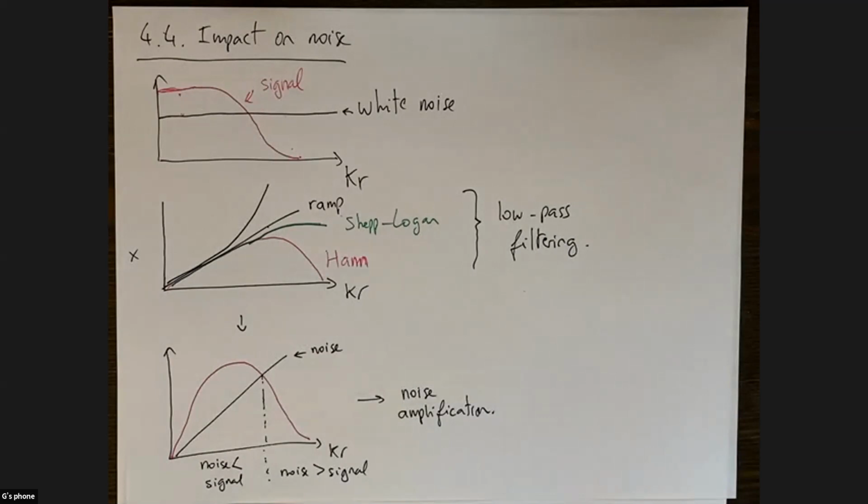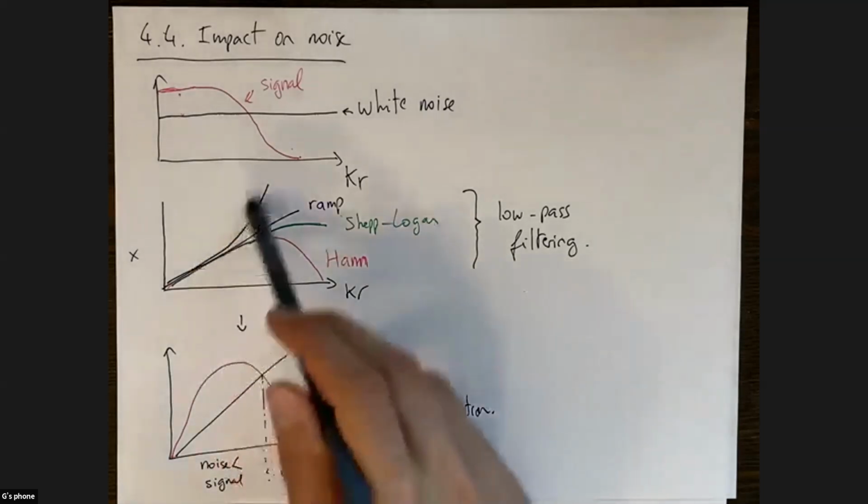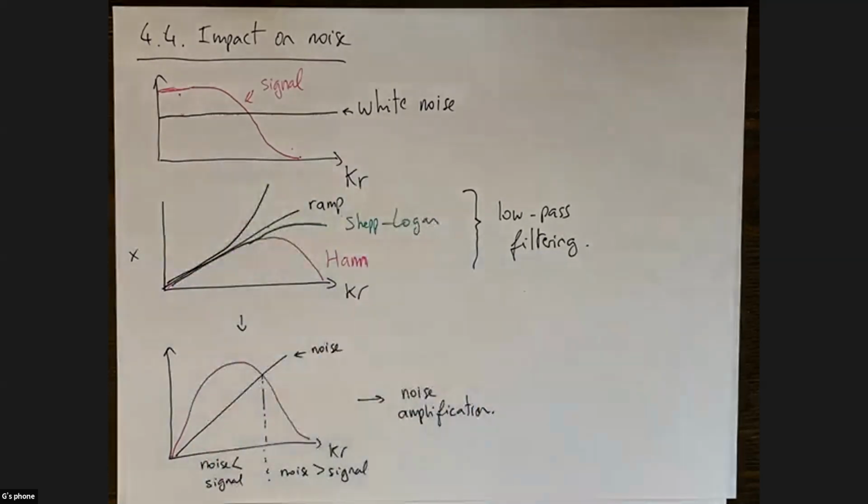The camera itself, which I didn't talk too much about, will attenuate some of the high frequencies because of the collimators and the detectors. And you could think about, like you say, adding a parabolic filter to try to remove the effect of the camera on the distribution. So that's something else, right? You could try to do that also, because your camera is losing resolution, it's losing high frequency information, and so you could try to compensate for that. But again, the issue is the noise.